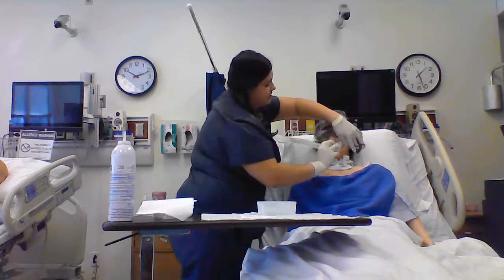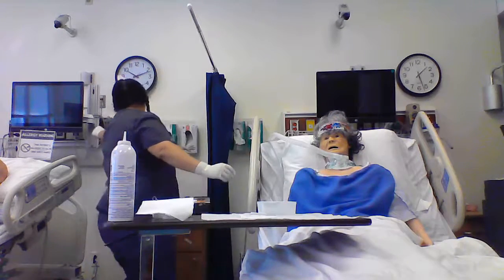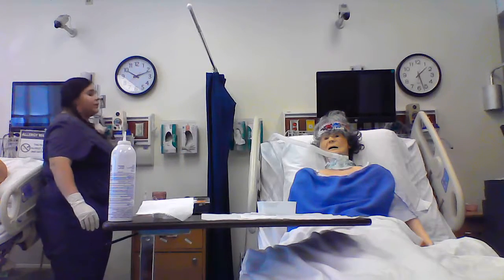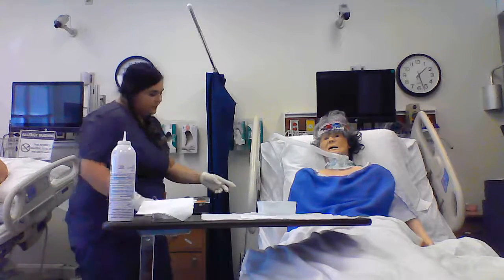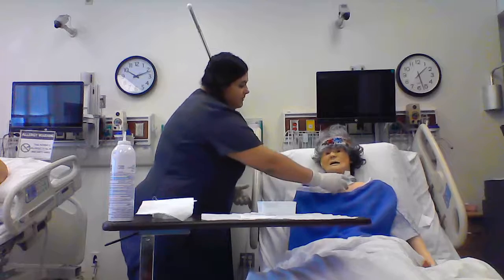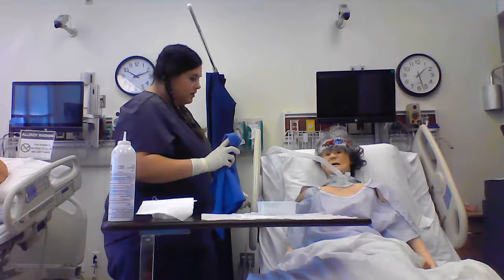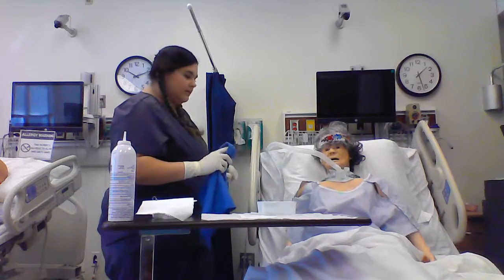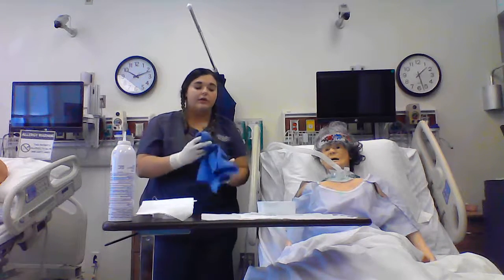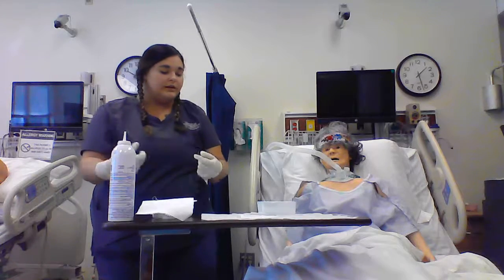Here you go, Ms. Opal. Here's some oxygen. I'm going to turn my oxygen back down to what it was before. I'm going to lower my patient back down here. I'm going to take the towel. My bed's going back up. Okay. Normally the bed stays down. I'm going to throw my towel in the dirty linens, and I'm going to undo my gloves.